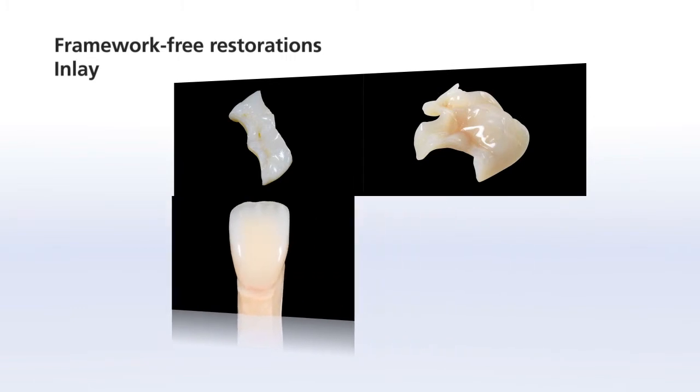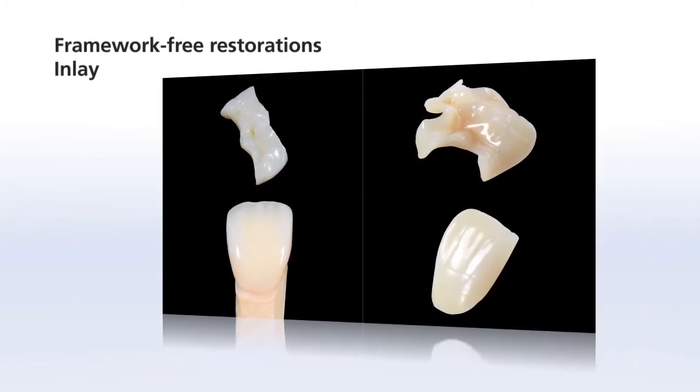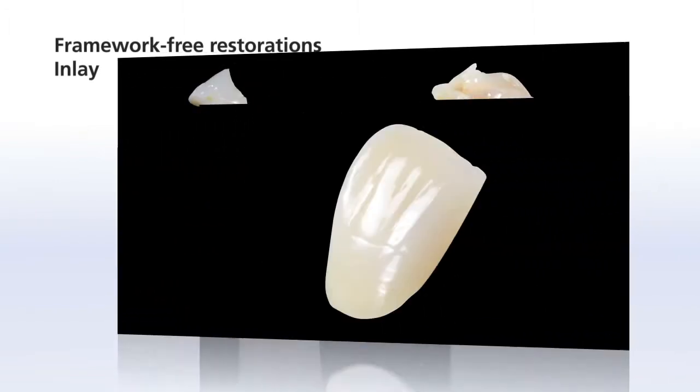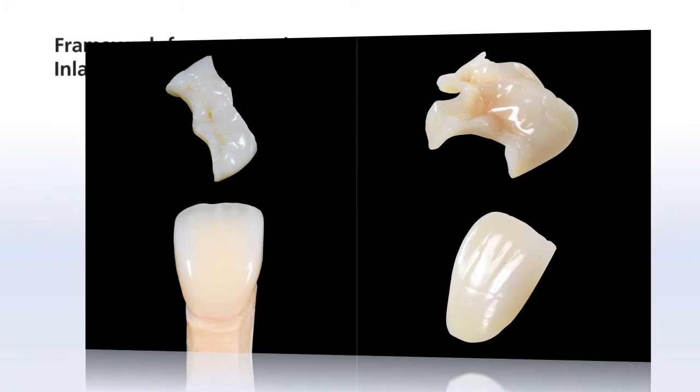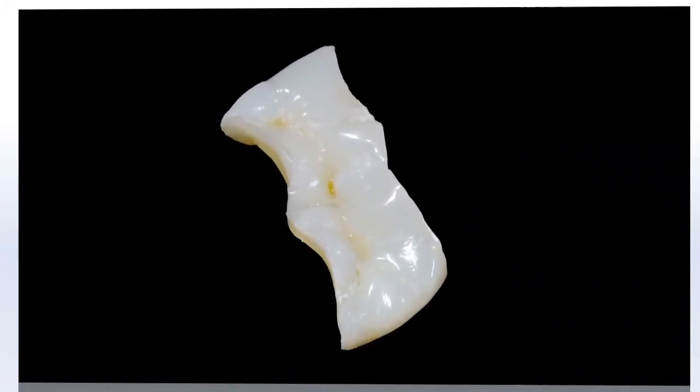SR-NEXCO can be used for various framework-free restorations. These restorations include inlays, onlays, anterior crowns, and veneers. This chapter shows you how to use SR-NEXCO to create an inlay.